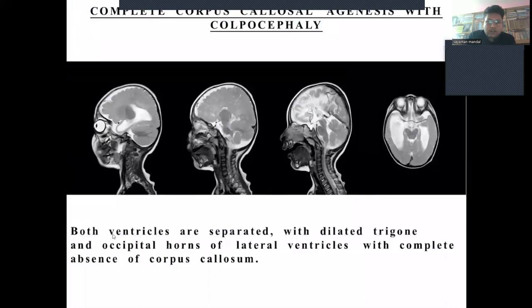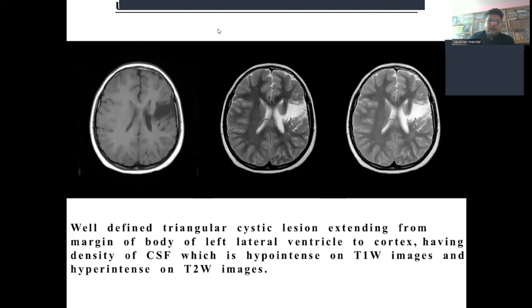This case shows dilated lateral ventricles bilaterally with absence of the occipital horns of both lateral ventricles and absence of the corpus callosum. This is a case of complete corpus callosum agenesis with colpocephaly. In this next case, we can see a well-defined triangular cystic lesion extending from the margin of the body of the left lateral ventricle up to the cortex, having CSF density — hypointense on T1 and hyperintense on T2. This is a case of unilateral open lip schizencephaly.